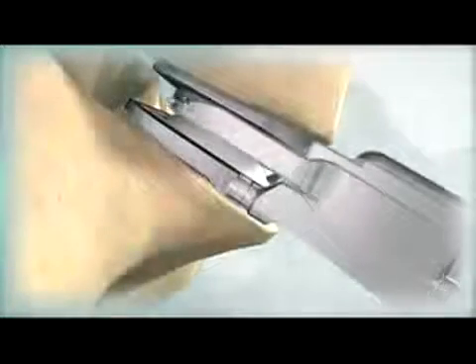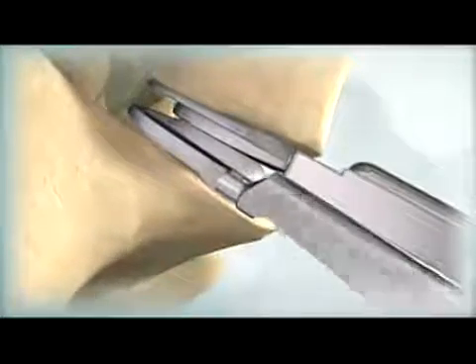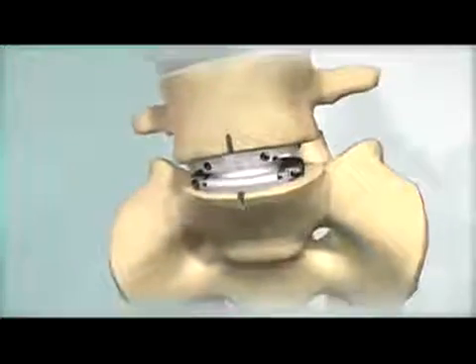Remove the instruments and verify final implant positioning. For more information, visit our website.